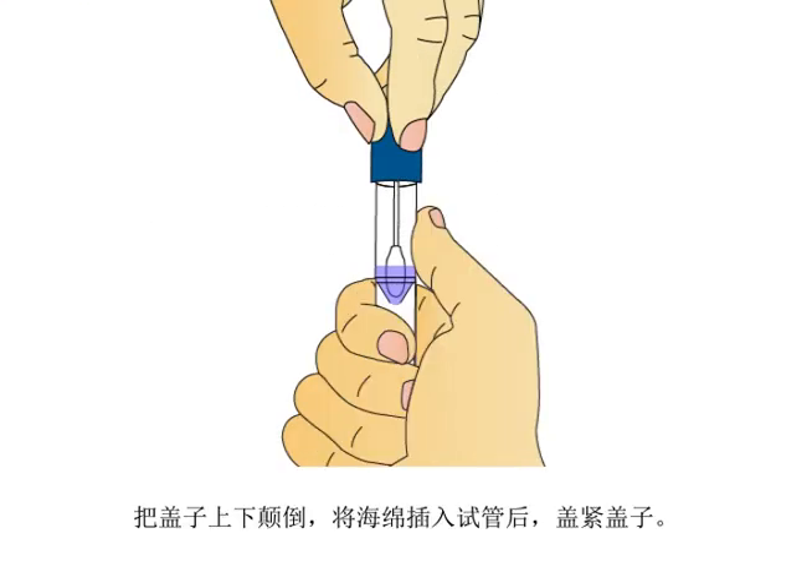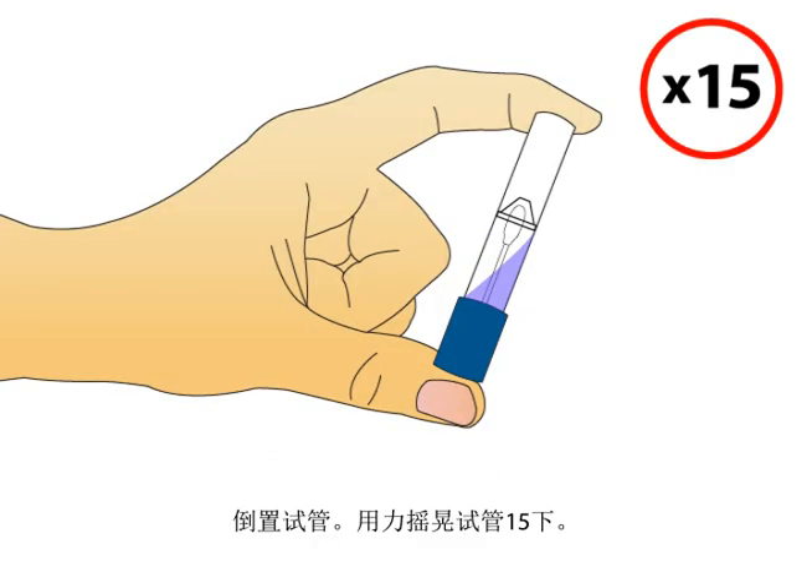Insert the sponge into the tube and close the cap tightly. Invert the capped tube and shake vigorously 15 times.